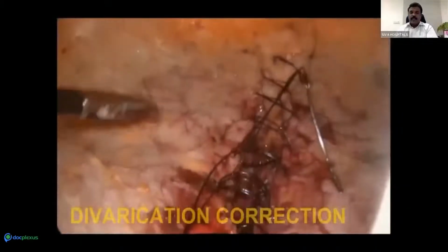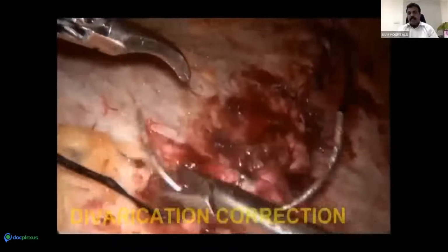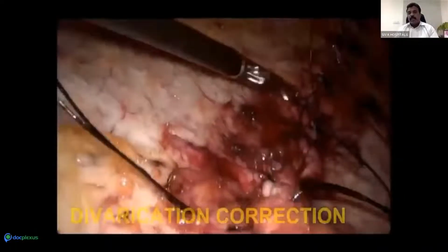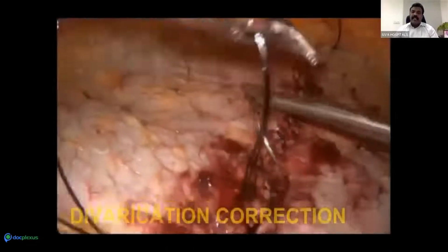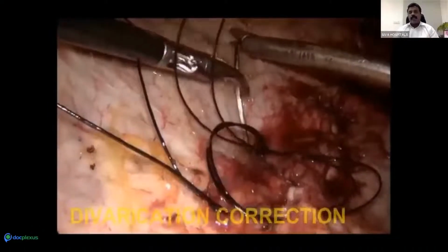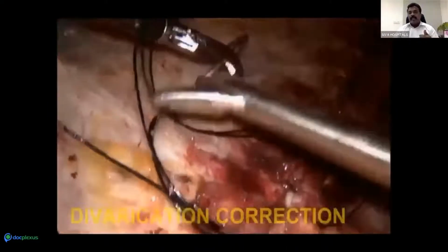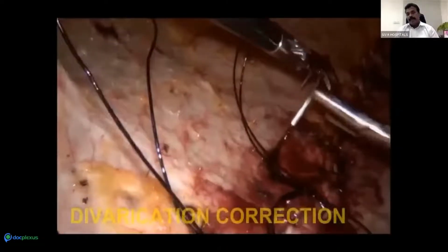If you are getting hurdles when you are coming near the pubic symphysis, you put a 5 mm scope on the left side and suture from the right working hand as well as the camera port. The only problem when we are taking the suture is the knotting at the end, at the pubic symphysis.